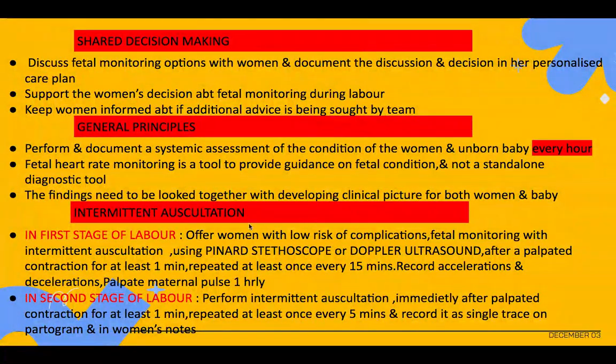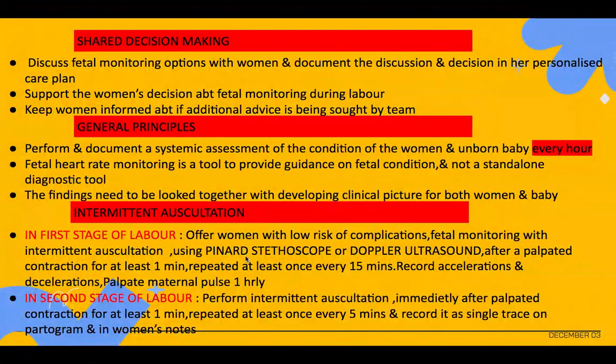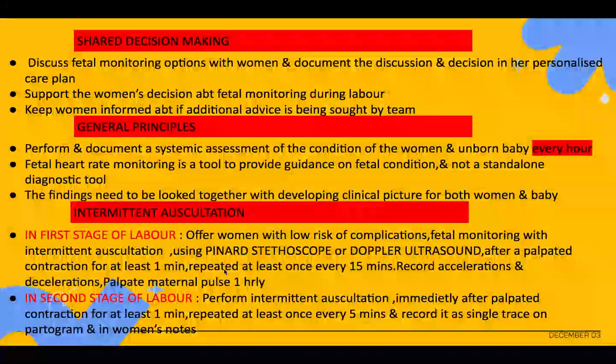Friends, in this session, I want to make this guideline super easy for you. No unnecessary details which are not required for your exam, because otherwise for fetal monitoring we can speak for a lot of hours, but this is not required, right? So I will only pinpoint those points which are important from your exam perspective, using the Pinard stethoscope or the Doppler ultrasound.